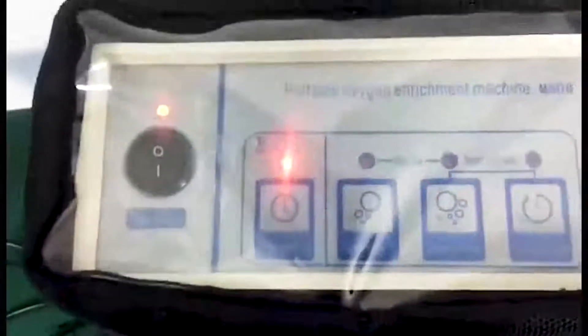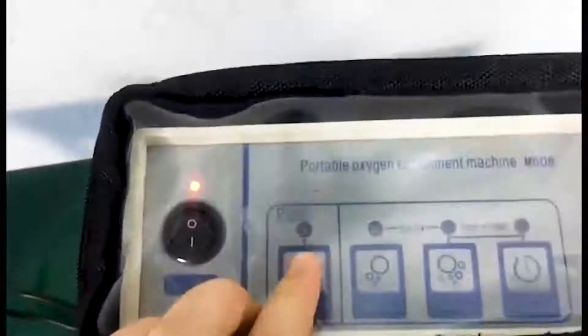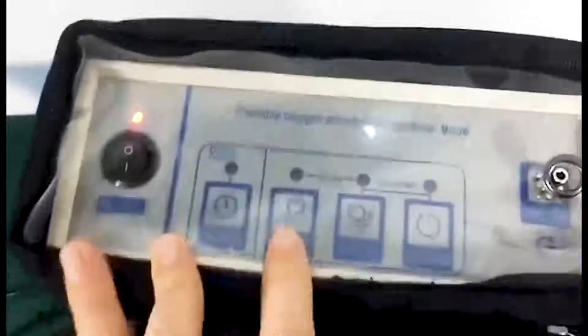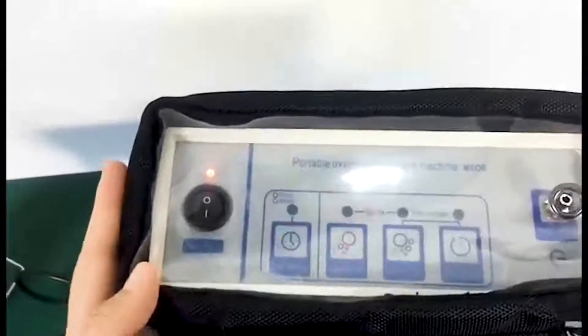You can use the machine in car. And this is one hour battery. Press the on and off button so that the machine will work.